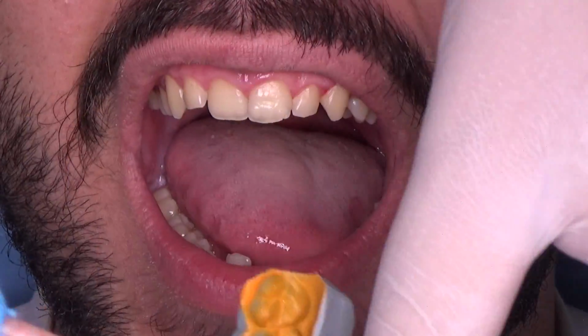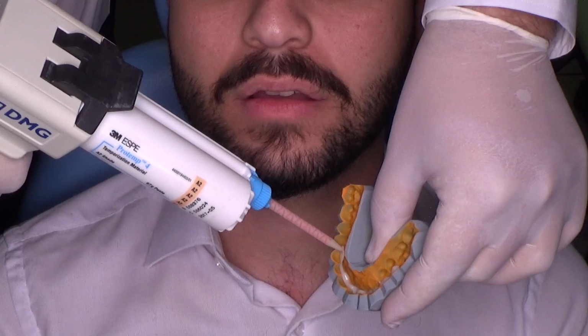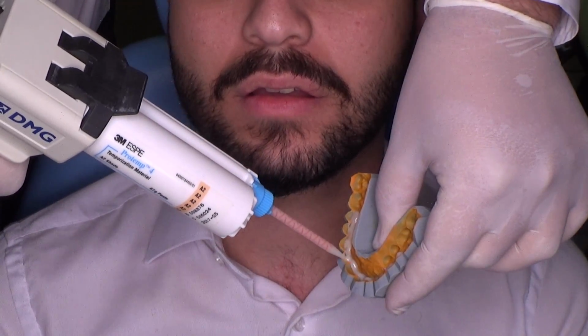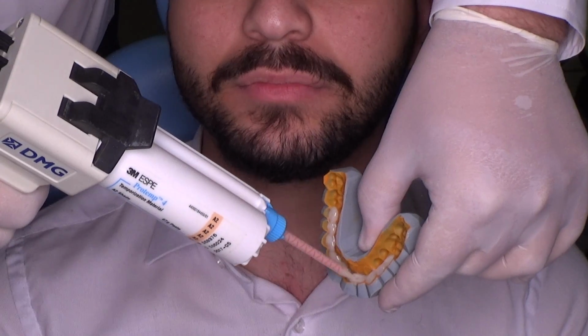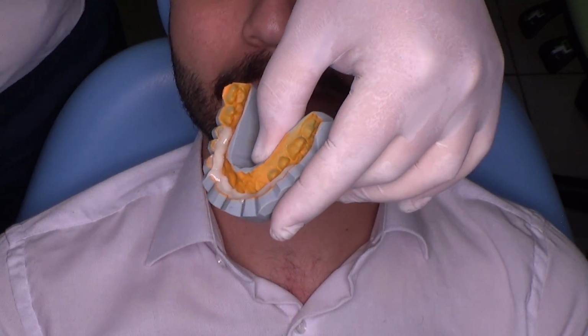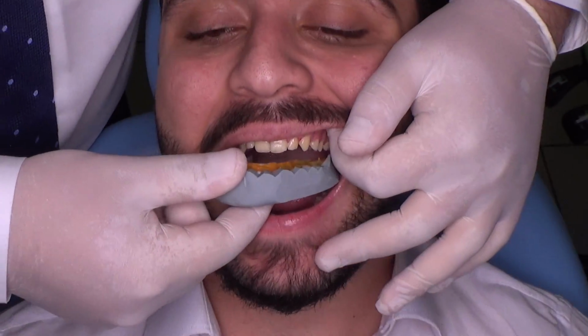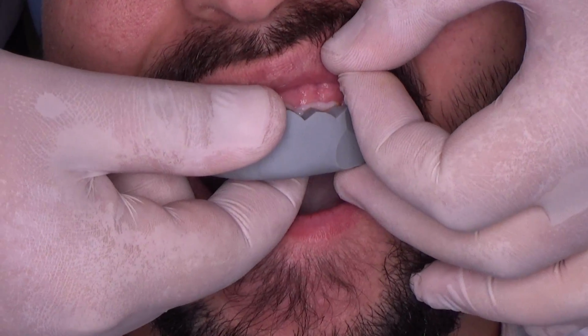So our mock-up is from 1.5 to 2.5. You have to put a little bit of bisacrylic out of the mouth, put it vestibularly, fill up the index from 5 to 5. So it is a photopolymerization composite, no? No, it is bisacrylic composite, which is not photopolymerization. Okay. It is self-curing composite.